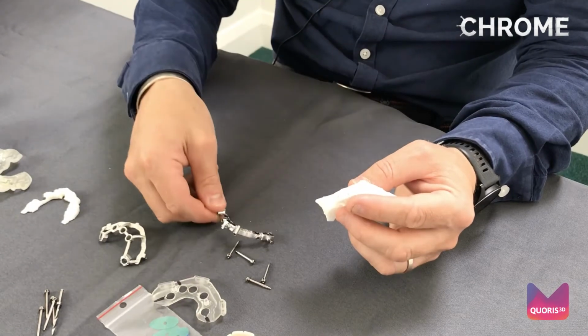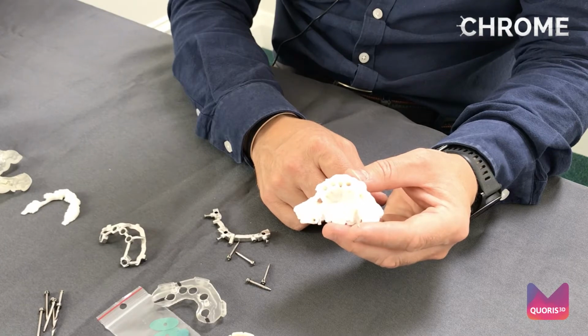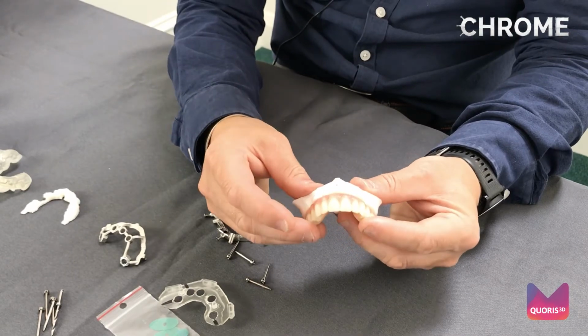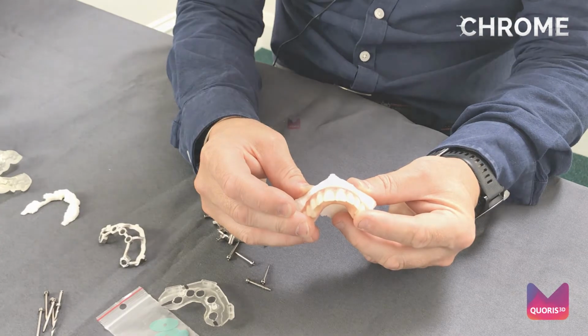Remove your fixation base and close the case up with your preferred suture material. At that point, then it's a matter of re-screwing or reattaching your temporary prosthesis and discharging your patient.